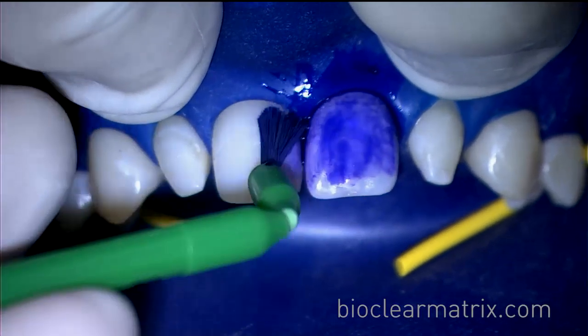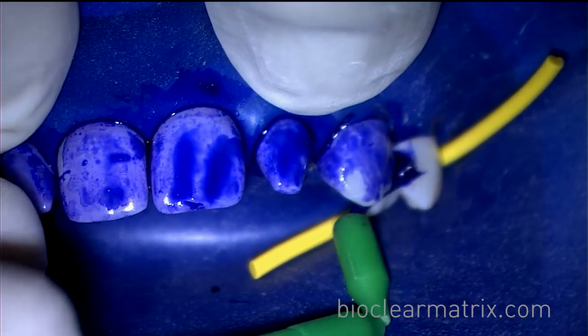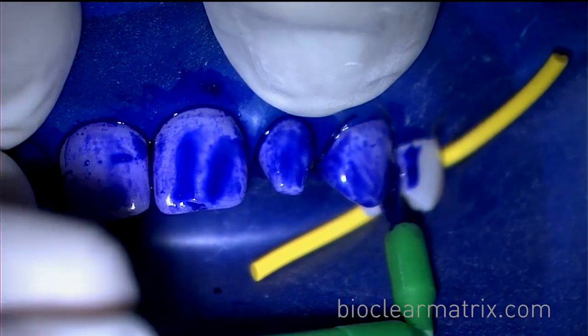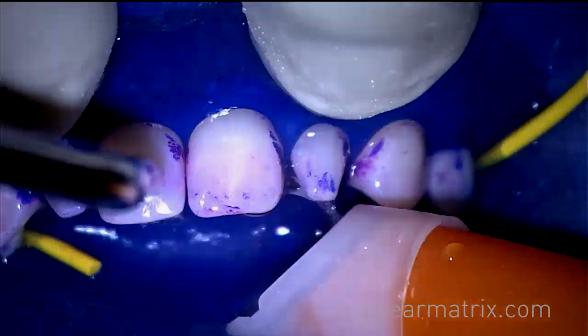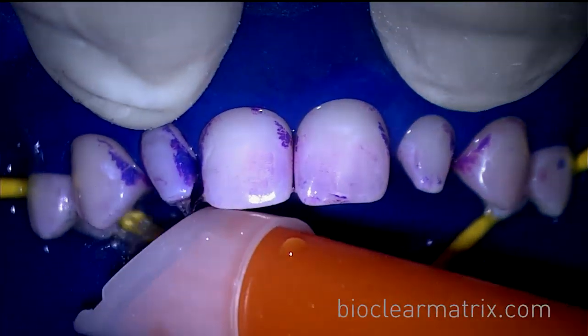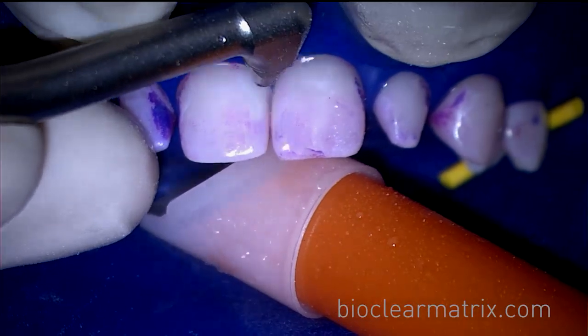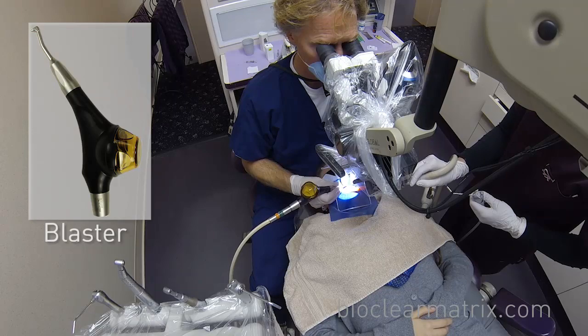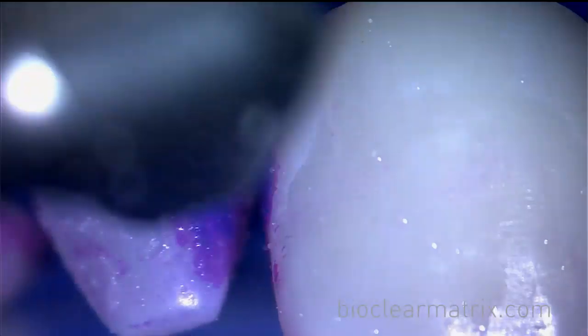Disclosing solution is then used to identify any areas of biofilm. Then, the use of the BioClear blaster is needed to remove areas of biofilm indicated by the disclosing solution.